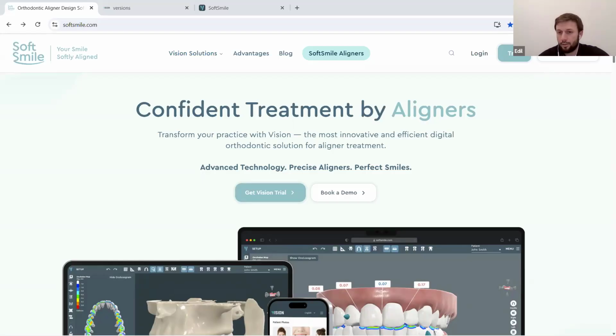Rematch workflow explanation, we will need to have a separate session for that. There's another question regarding updates to the tooth numbering feature, if instead of it being raised, it could be embossed. Not yet, not available at the moment. We're working on that as well, but it's not part of this release.